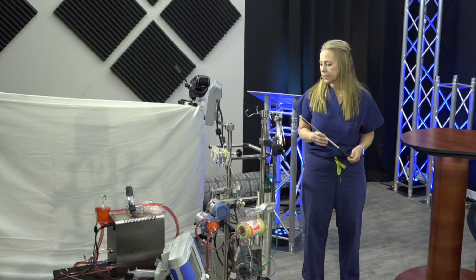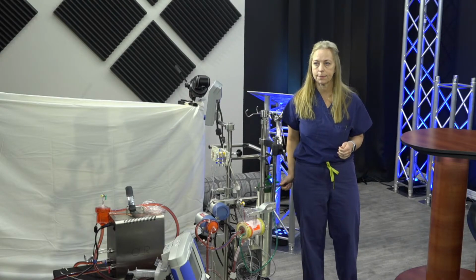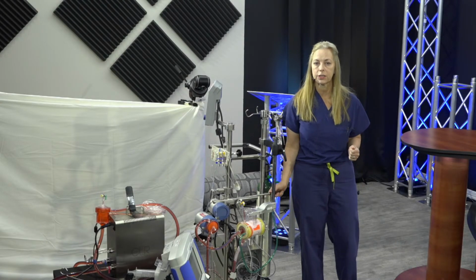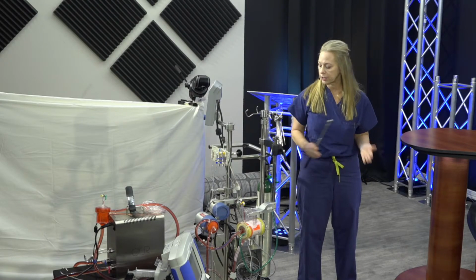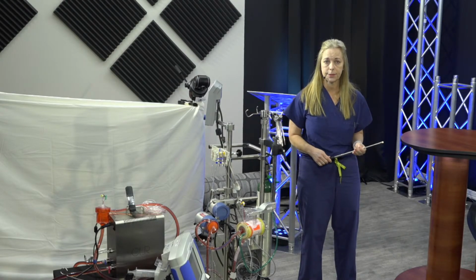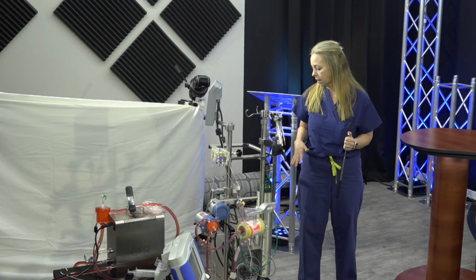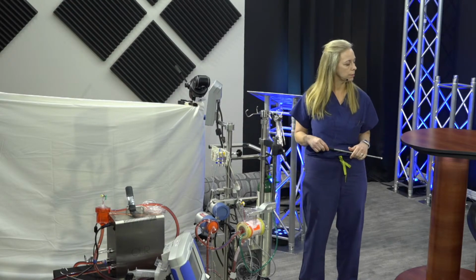Another thing to consider is, how many ECMO pumps are you going to purchase, and what are going to be your backups? We happen to go with this device because it's compact and very versatile, but it also has the same external drive that we use on our bypass pumps. So that way we have a little bit of interchangeability between them if we ever got into a situation where now we've got all of our ECMO pumps in use. What's your backup pump? What if you have some sort of failure? And so that went into the planning for our particular ECMO machines and what we were going to have available at our facilities. Okay, very good, excellent points.